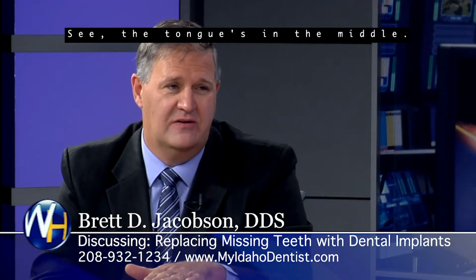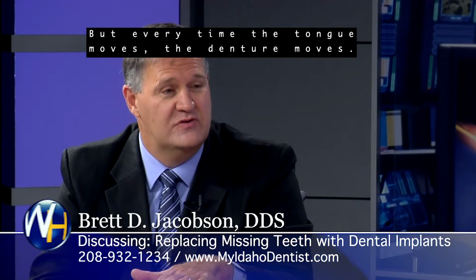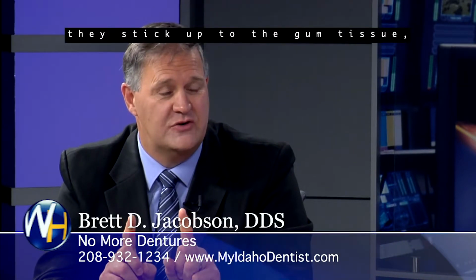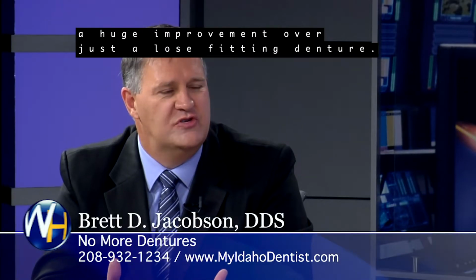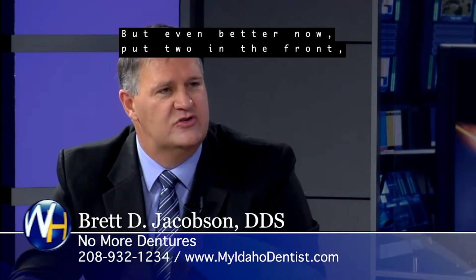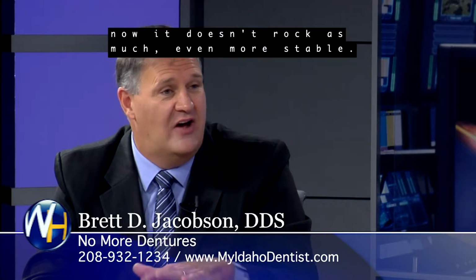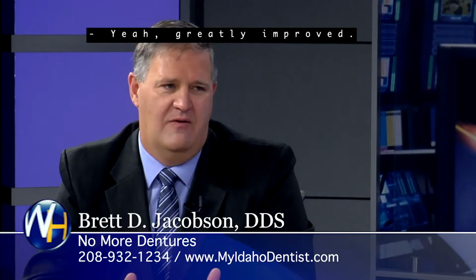Works pretty good. Way better than just dentures that move around. See, the tongue's in the middle, and the tongue's job is to put the food onto the denture. But every time the tongue moves, the denture moves. So you put two implants in, they stick up through the gum tissue. Now it can't move the denture. You just snap it in, snap it out. That's great. A huge improvement over just a loose fitting denture. But even better than that, put two in the front, two in the back, because the two kind of rock front to back. But if you put two behind it, now it doesn't rock as much. Even more stable. So that's a better option. Way better. Yeah, greatly improved.